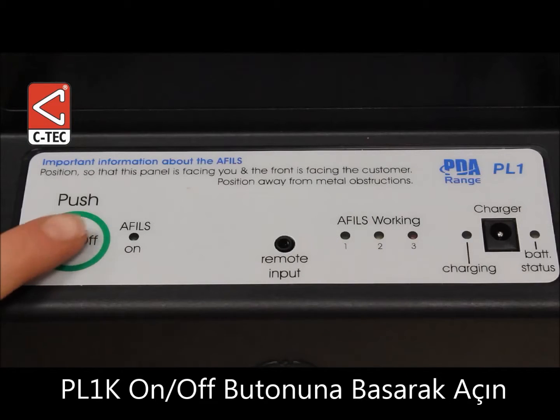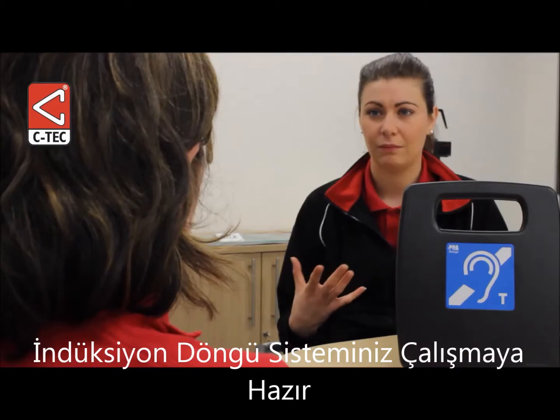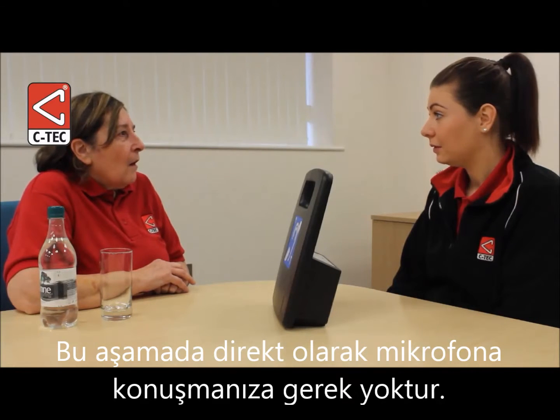Press the amplifier's on/off button once. The amplifier will beep to confirm it is ready to use. Talk to the hearing aid user as normal. You do not need to talk directly into the internal microphone as it has a wide pick-up range.